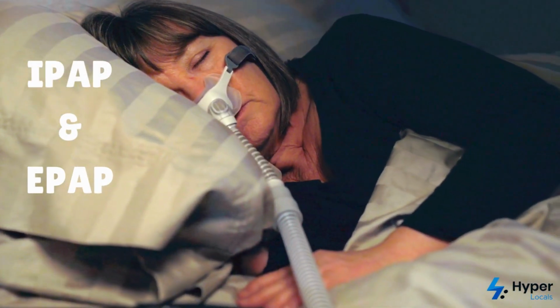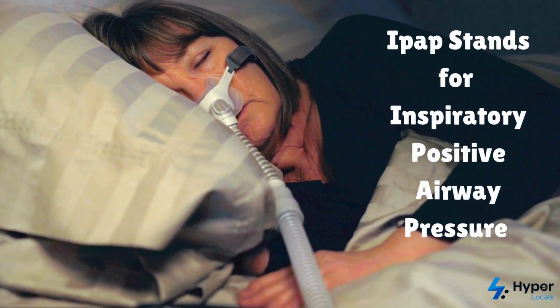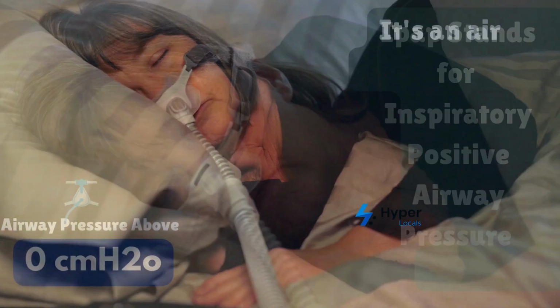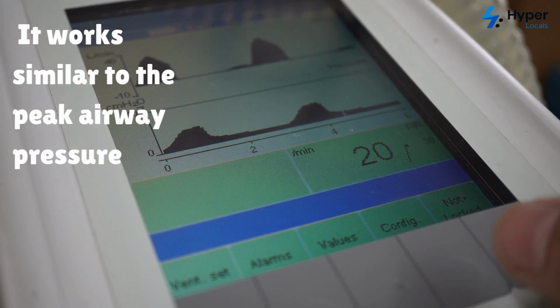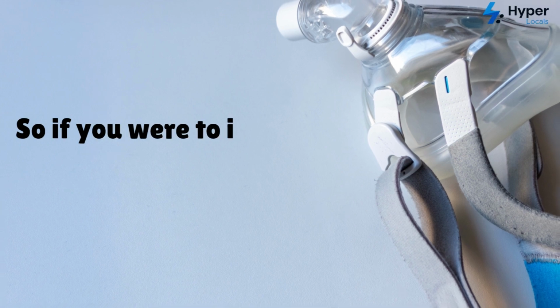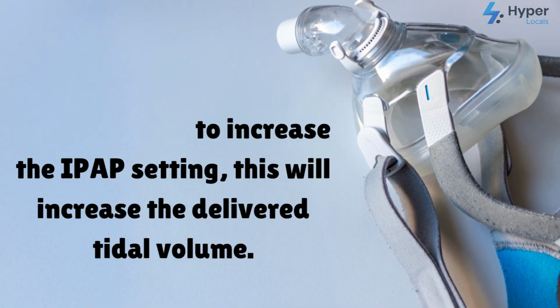As I mentioned, BiPAP is a type of non-invasive ventilatory support that gets its name because it provides two levels of pressure, IPAP and EPAP. IPAP stands for Inspiratory Positive Airway Pressure. It's an airway pressure that is above zero during the inspiratory phase of breathing. It works similar to the peak airway pressure in traditional mechanical ventilation. So if you were to increase the IPAP setting, this will increase the delivered tidal volume.